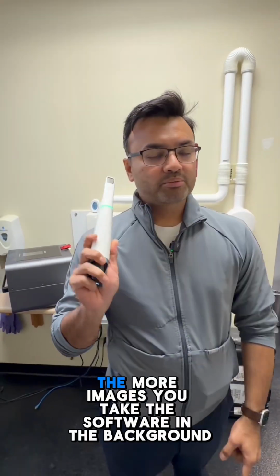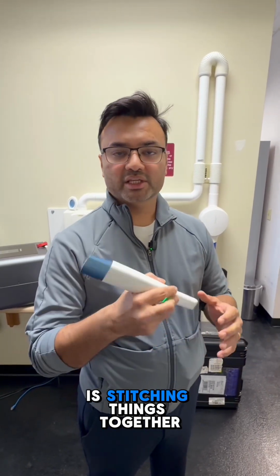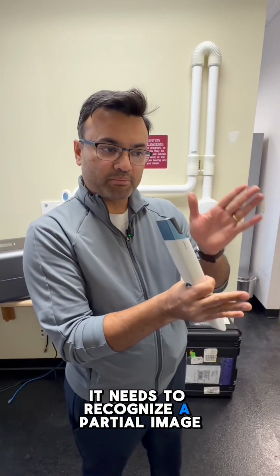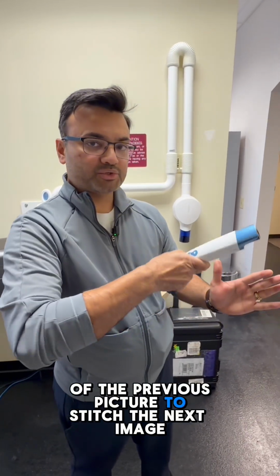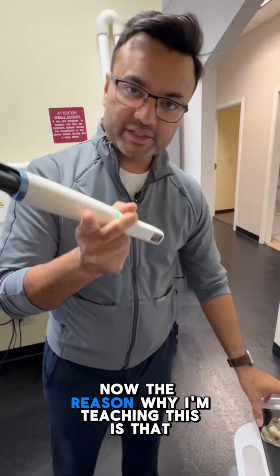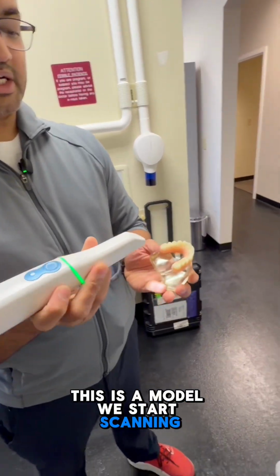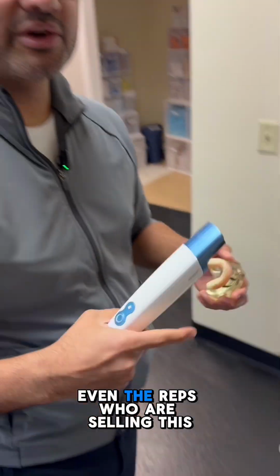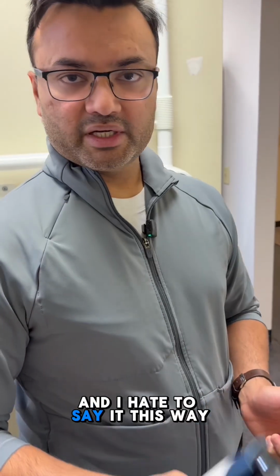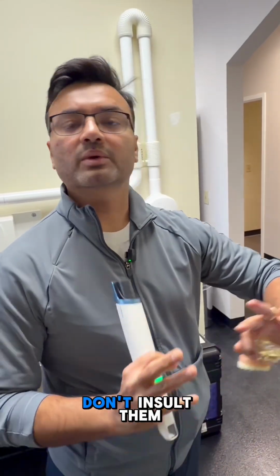This is a camera. The more images you take, the software in the background is stitching things together, meaning every image you take, it needs to recognize a partial image of the previous picture to stitch the next image. That's how you get a 3D scan. Now the reason why I'm teaching this is that, let's say we are doing a test, this is a model, we start scanning. Believe it or not, even the reps who are selling this are going to teach you to go this way. And I hate to say it this way, but throw that thought out of your head. Let them teach you the wrong way. Don't insult them.